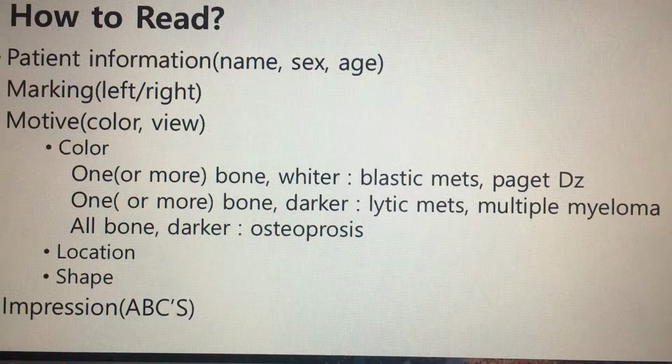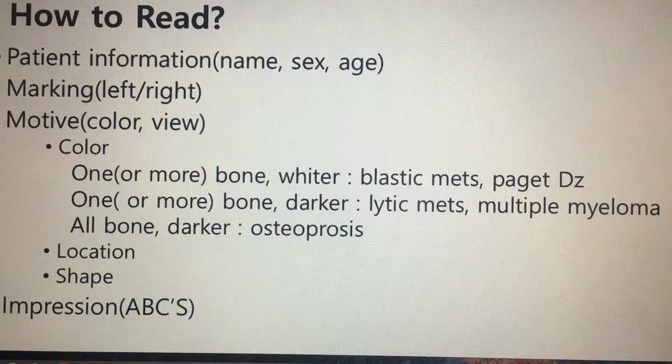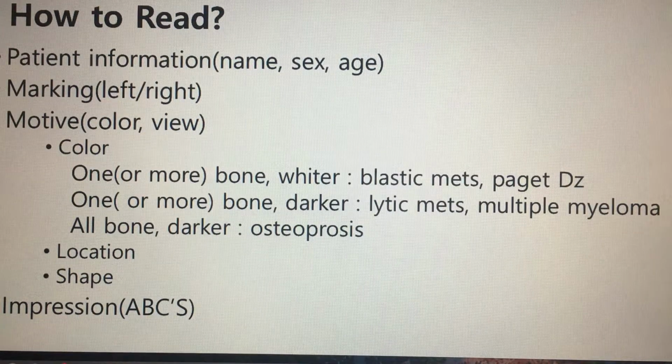How would you assess an X-ray if the patient had taken one to confirm the diagnosis? In the image, we should check patient information and positional marking. Then we could check color, location, and shape of the region for clinical radiology pathologies. Once you get used to seeing normal X-rays, you will learn more about regions.